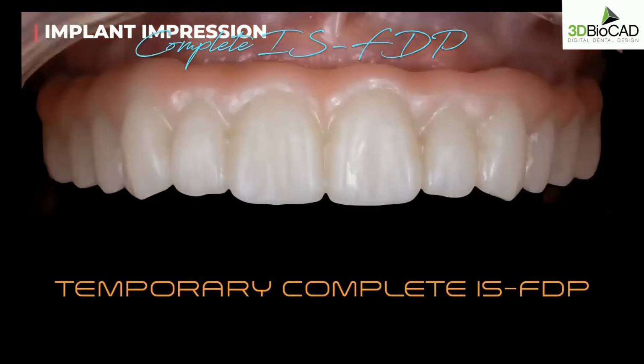And then another check that we do is we make a temporary full arch bridge, like you see here, and then we try this inside the patient's mouth to see if the restoration is passive, and we also check the aesthetics, phonetics, and the occlusion as well.